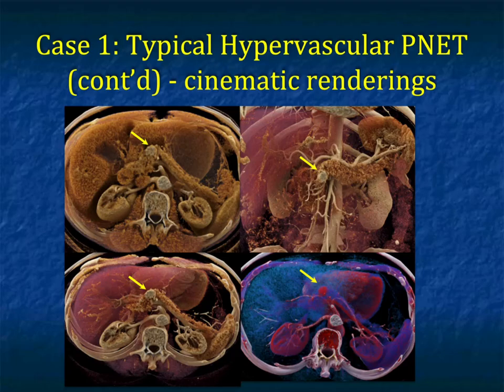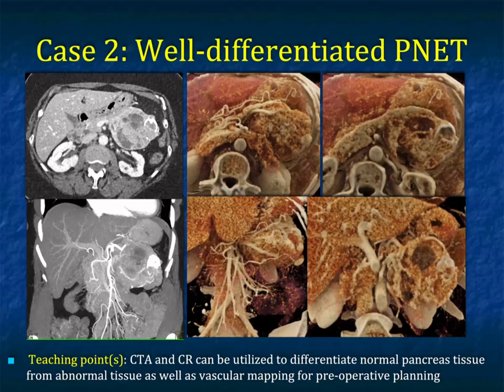Here's the same lesion on CT, and then with cinematic rendering — very nicely showing the lesion. You can see it with a range of cinematic renderings. Very small lesions can be brought out with cinematic rendering by looking for changes in texture based on vascularity.